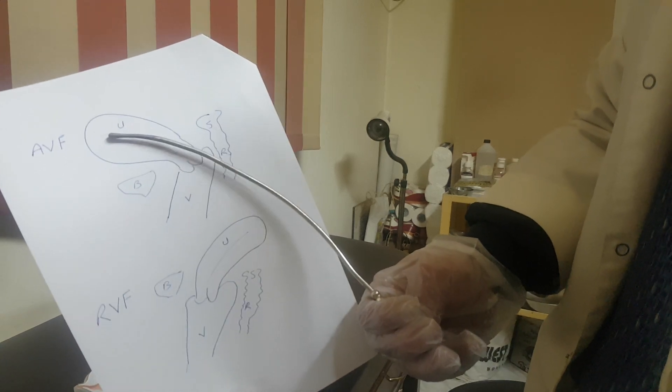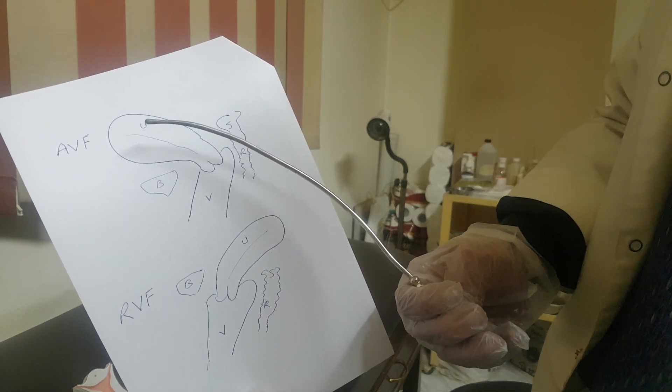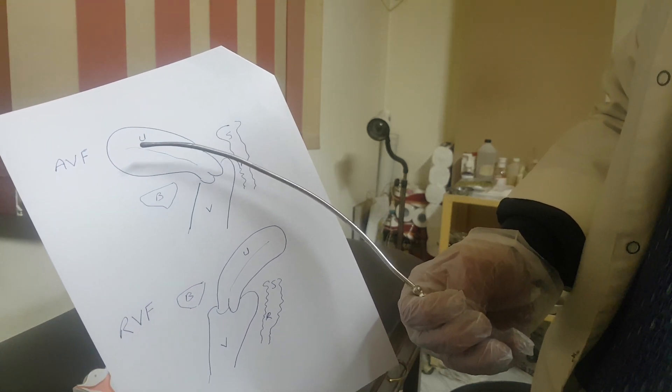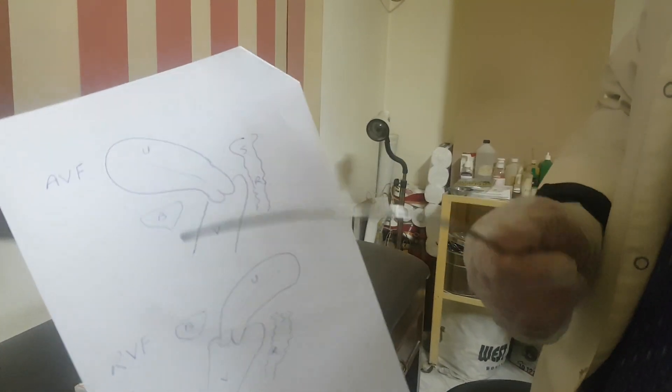When you insert the uterine sound in this direction, this is an AVF uterus — I can diagnose it. AVF uterus constitutes 85% of women, while RVF uterus constitutes 15% of women. If inserting the uterine sound in an RVF uterus, you should go in this direction. If you go in the wrong direction and push forcefully, you may perforate the anterior wall of the uterus. So be careful while doing uterine sounding to go in the correct direction of the uterus. The upper figure is AVF and the lower figure is RVF.